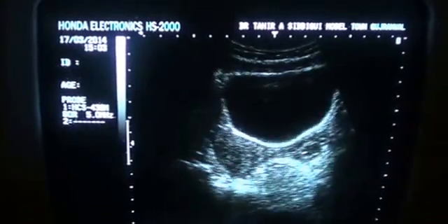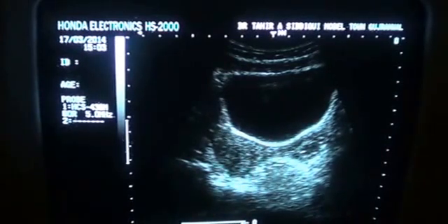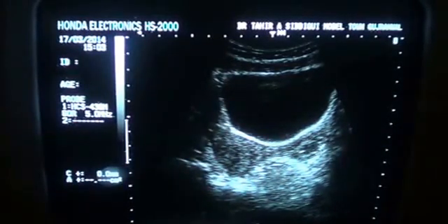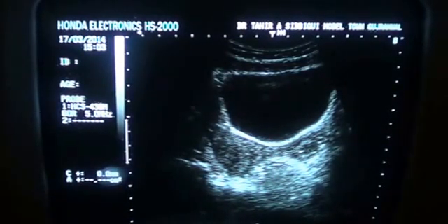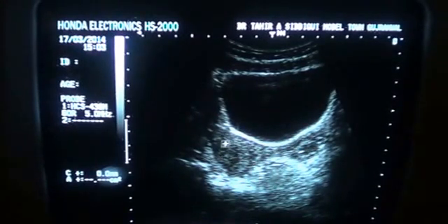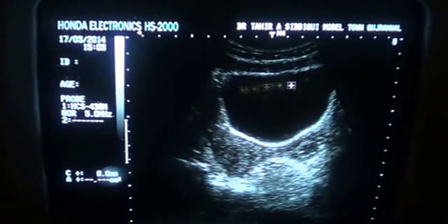This is the left ovary, and these are the follicles seen developing. This is the transverse section and this is the urinary bladder.